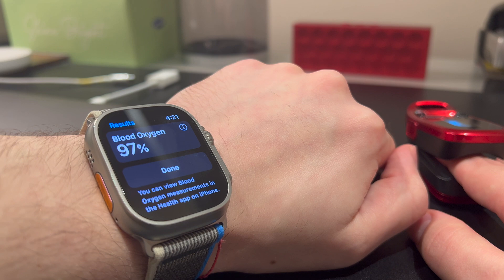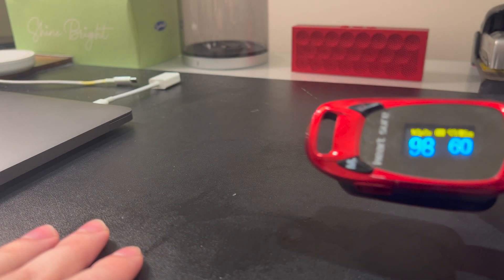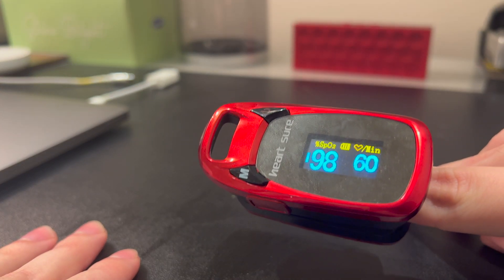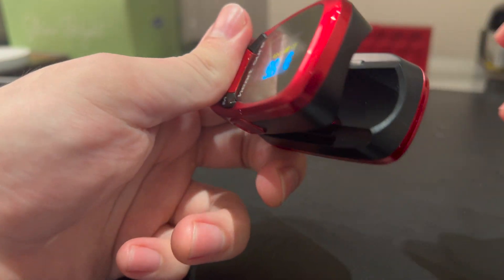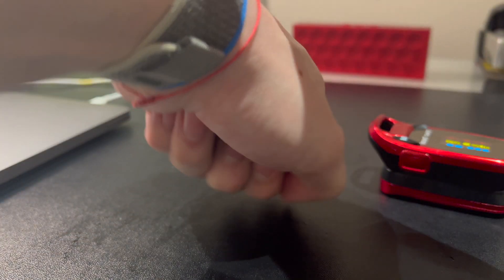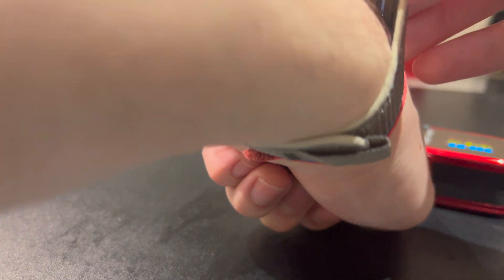It's showing 97% again on this one on the Apple Watch Ultra, and on the blood oxygen SPO2 monitor it's showing 98%, so fairly similar as well. It does use infrared red light, as you can see here, same as the Apple Watch Ultra — which when you're running it, you can see those red lights.